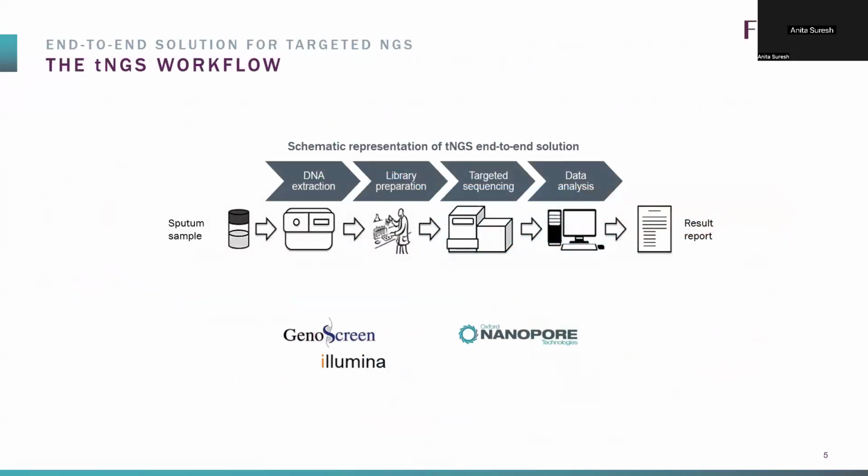Before I continue with the data part, since I keep saying end-to-end solution, let me clarify exactly what we evaluated, and what WHO is looking at as well. It is an end-to-end sequencing solution that goes from taking the sample, in this case the sputum sample directly, to the end result, which is a report.